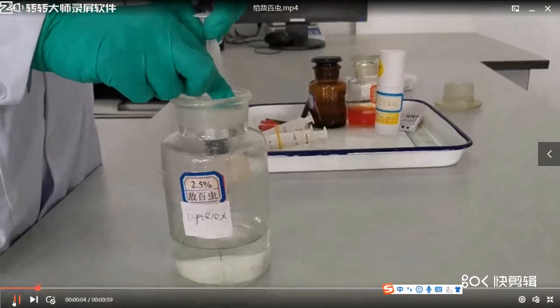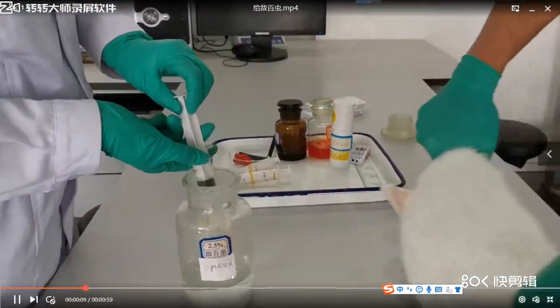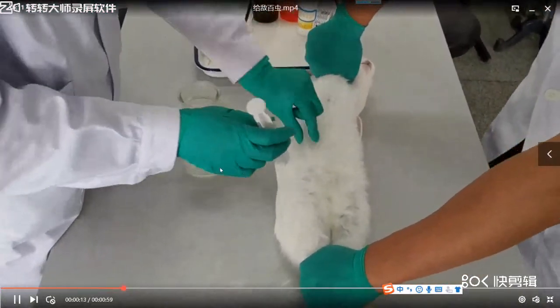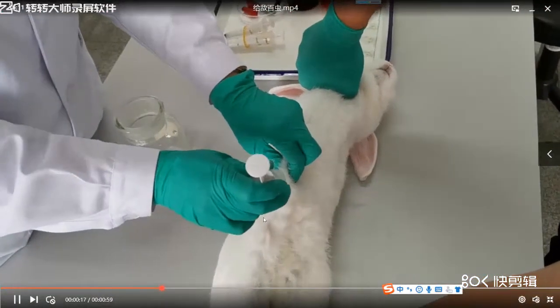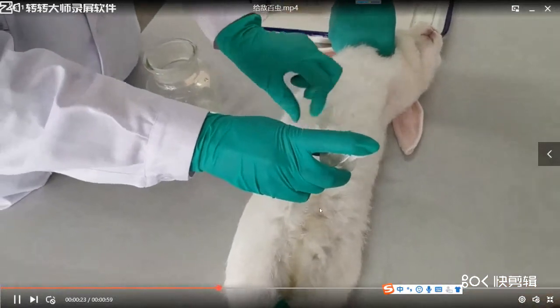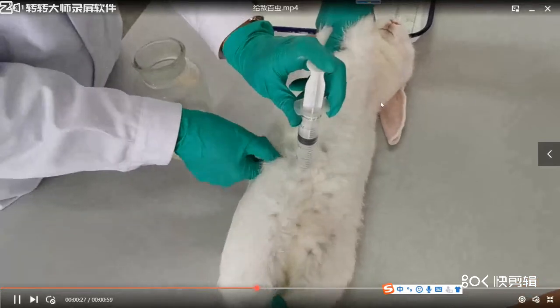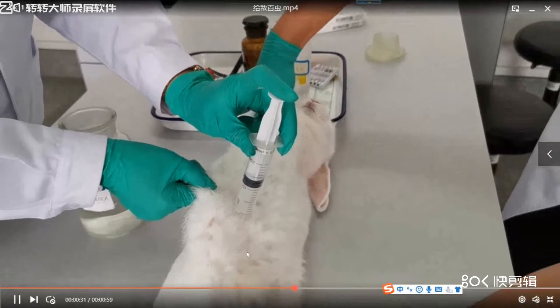Okay. At first, we give the organophosphate. The drug is dipterex, Chinese name dibaicheng. We use 2.5% dipterex by intraperitoneal injection, near the middle line of the lower abdominal cavity. This rabbit is 2 kilograms, so we give 12 milliliters of dipterex.